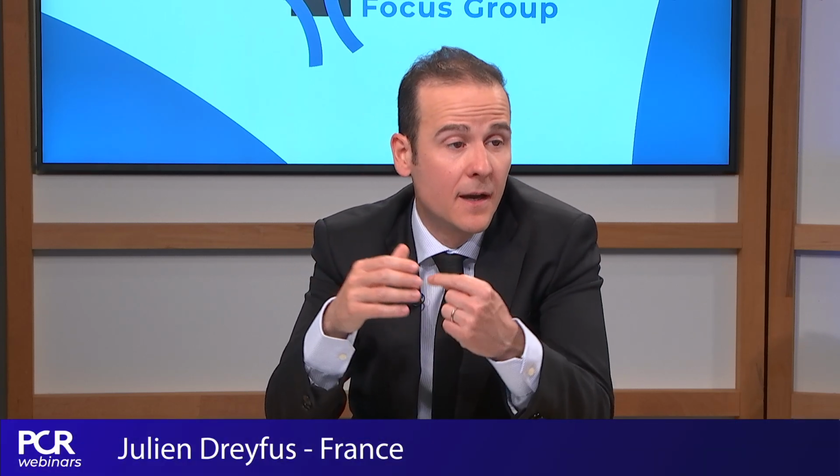Yeah, it's what I previously mentioned. In fact, it will depend on two things. First, the mechanism. If the lead is inducing the TR, then you should not consider a transcatheter edge-to-edge repair. And the second point is the location of the lead. If the location is in the commissure, posterior septal commissure, it won't prevent any implantation of a clip, while if it's anteroseptal, usually it will be difficult to implant. So the mechanism and the location are the two things to consider. I agree, and I think edge-to-edge repair is a good option for this patient if it's not adherent to the leaflet. The lead can be moved as well, so that's definitely an option.